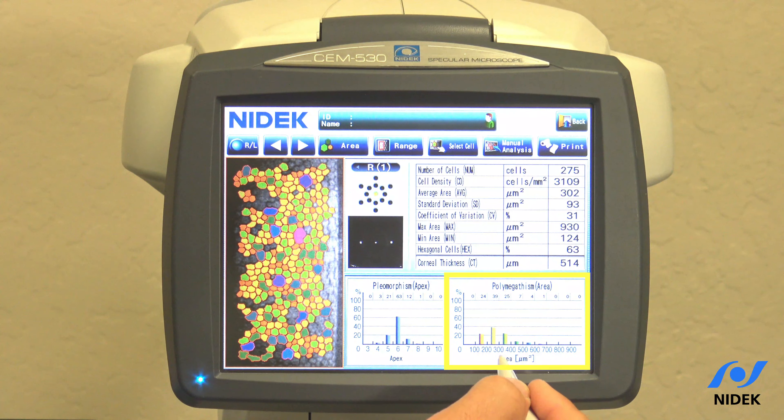If I go in apex and click OK, we are now in pleomorphism, which is the shape of the cell. You can see here hexagonal cell — six-sided — is the highest.